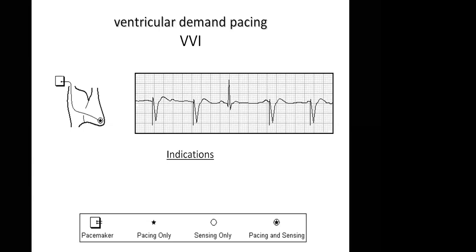Well, from the lettering, it's the ventricle. But look at the ECG, because you don't see letters when the patient brings an ECG to you. It's only the tracing you see. So look at this, right? Did you see a pacing spike here? No, that's the intrinsic activity. So that means what? What do you think will have happened?